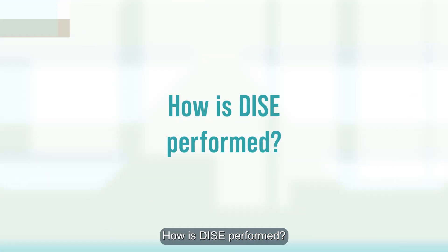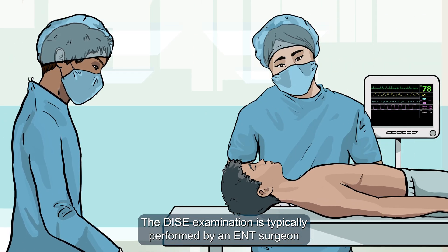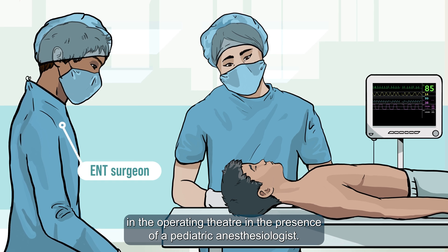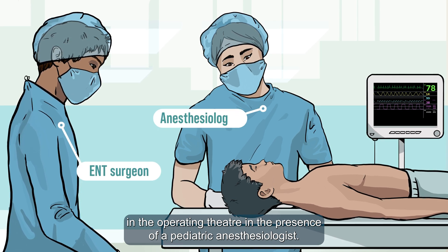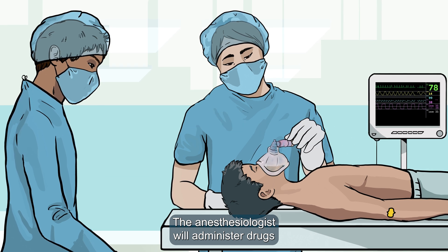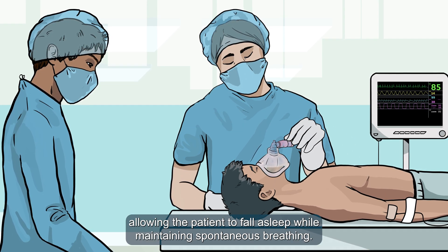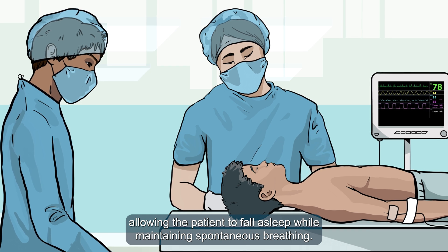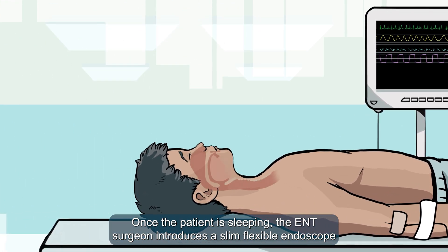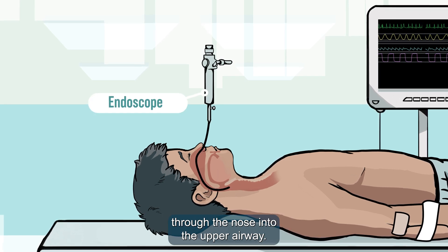How is DISE performed? The DISE examination is typically performed by an ENT surgeon in the operating theater in the presence of a pediatric anesthesiologist. The anesthesiologist will administer drugs allowing the patient to fall asleep while maintaining spontaneous breathing. Once the patient is sleeping, the ENT surgeon introduces a slim, flexible endoscope through the nose into the upper airway.